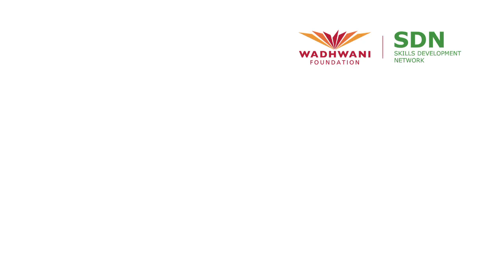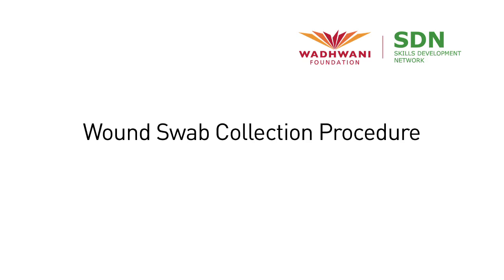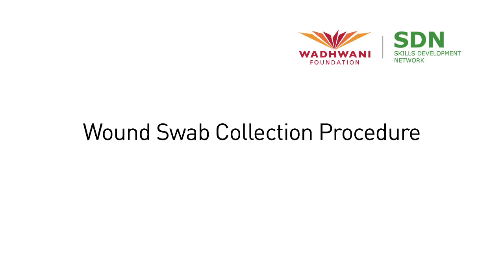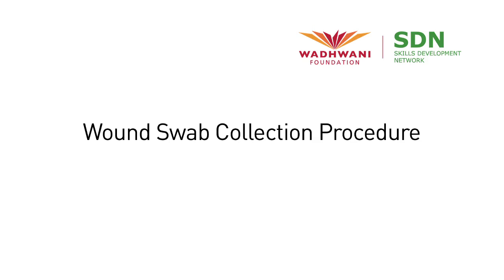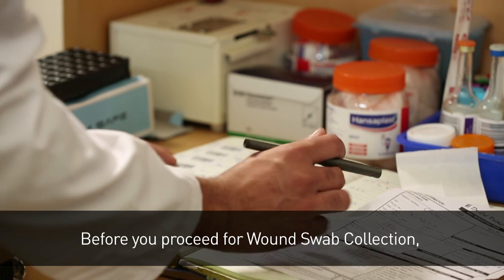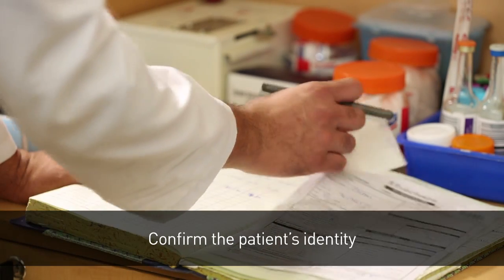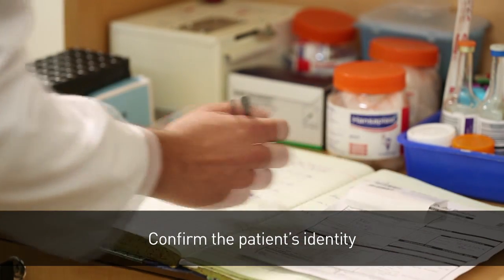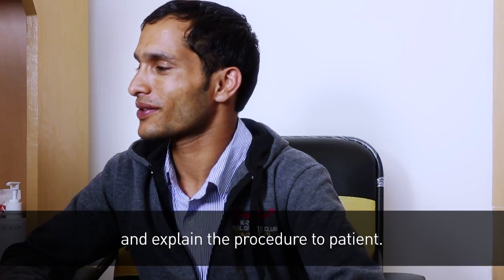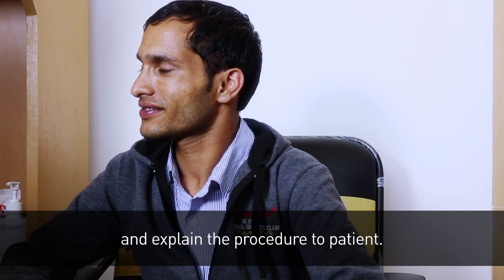Welcome to a video on wound swab collection procedure. This video is brought to you by Wadhwani Foundation. Before you proceed for wound swab collection, confirm the patient's identity and explain the procedure to the patient.